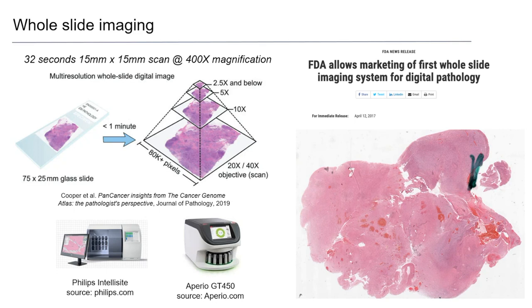You see this wheel here, it's queuing, or it's a little choppy, because I'm on a slow connection. But what happens is you get this digital image and it has multiple resolutions stored in it, and it allows the pathologists to review these things remotely through a network connection, and to seamlessly zoom through and pan through the images, and to do their diagnosis in a digital fashion. That creates a lot of opportunities, and we'll talk about all of those opportunities. We're really just in the early phases of diagnosis.